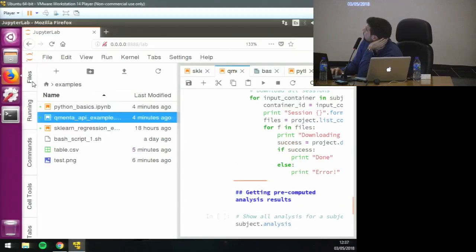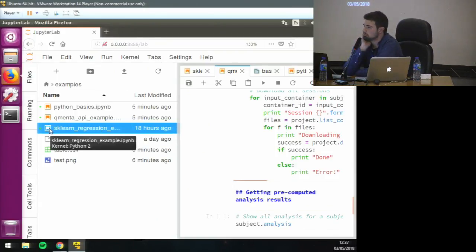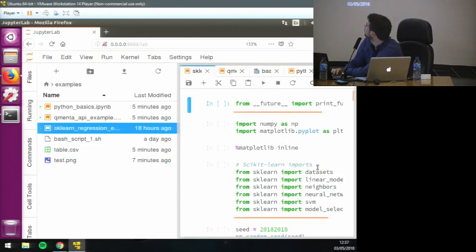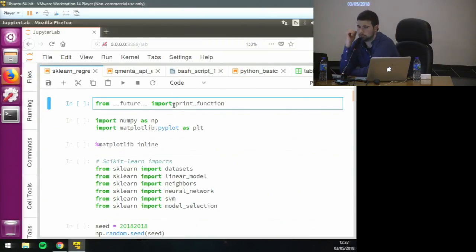Okay. Now we'll go to what I think is the most interesting part, which is basically how can you do even the simplest approach of machine learning to actually know something from this, to actually make a machine that can predict the age. For this, I'm not going to be using T1 data nor the output of ANTs, because that would directly be the answer to the challenge. But I'm going to use instead some synthetic data that we'll be generating as we go.